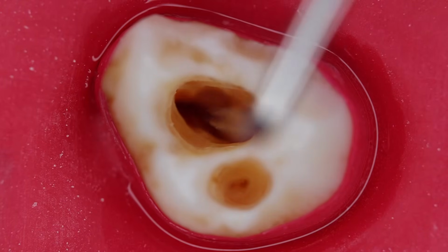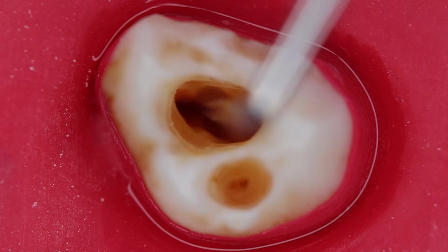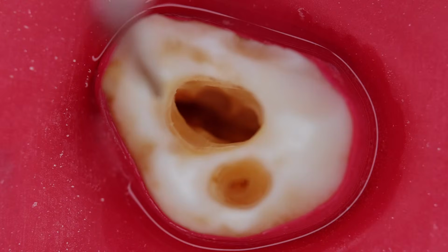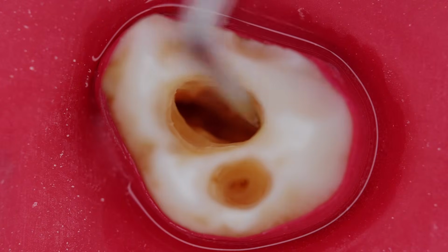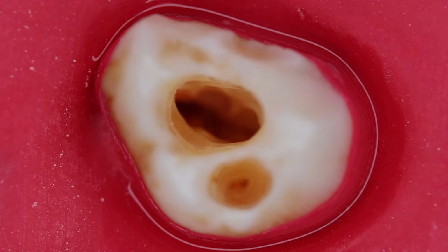Otherwise, you should also explore for the mesobuccal 1 and 2, which would be mostly located in this line, that is mesially and palatally. So the sequence would be starting from the mesobuccal cusp, going more mesially and palatally. You would be able to locate MB1 and MB2.